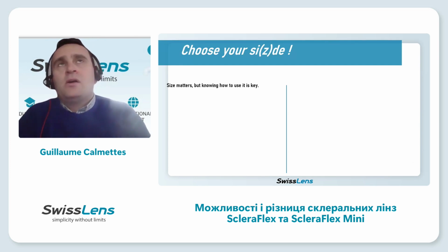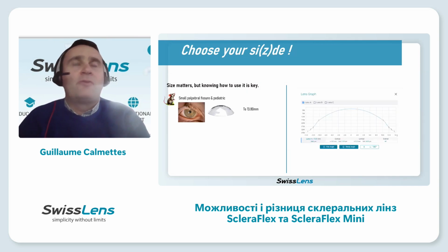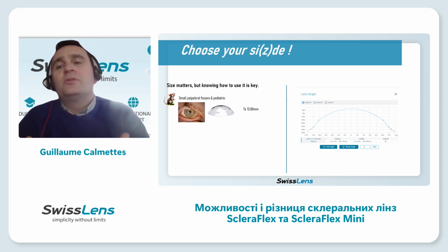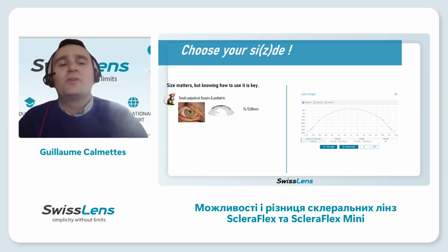So why do we have to choose the right diameter for scleral? It's very important to choose the right one, because it changes your fitting. For example, if you want to fit a very small palpebral fissure, or for pediatric, if you try to put on a lens with a 17 millimeter diameter, it will not be very easy for you, and for the patient, it could be a little bit more stressful.